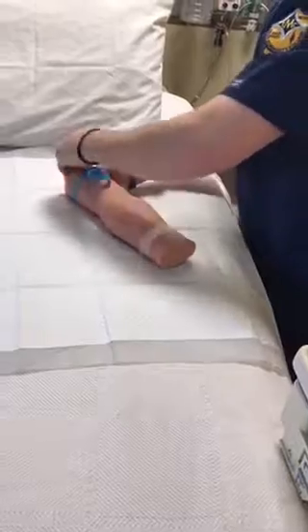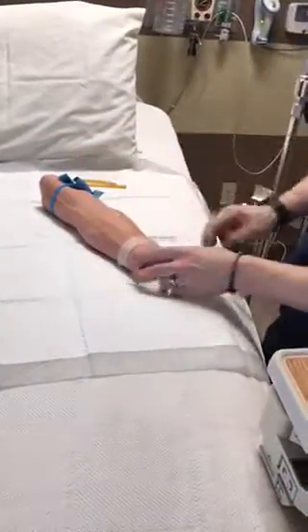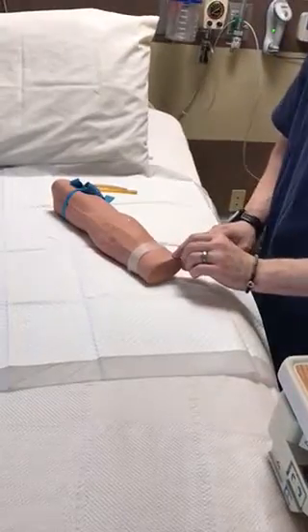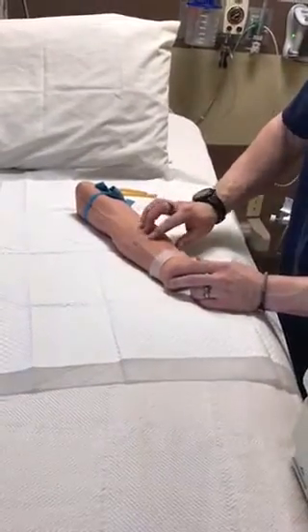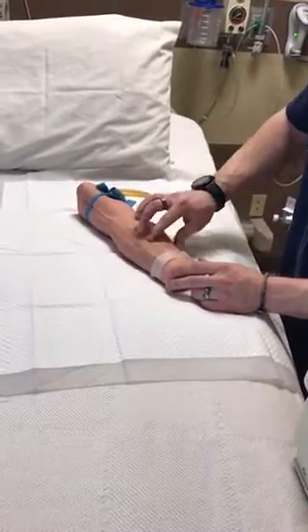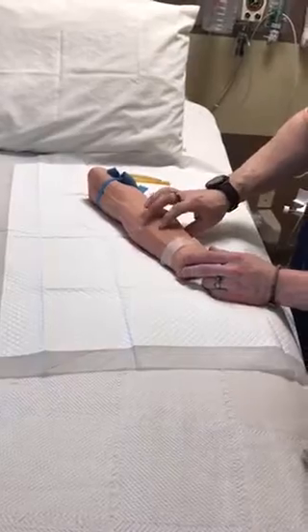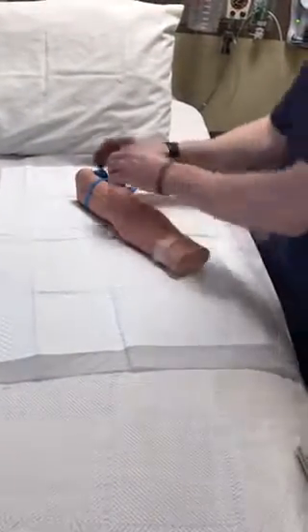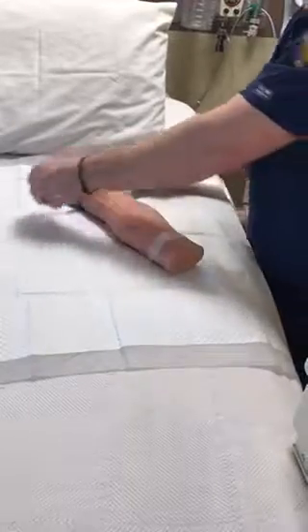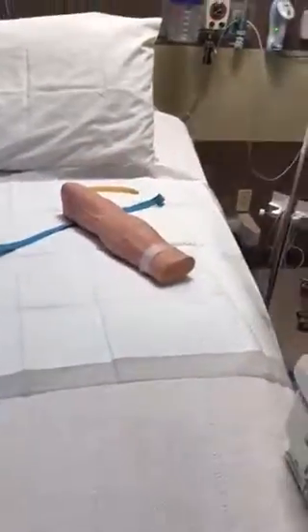tourniquet like that, and I'm going to go ahead and feel for a radial pulse, which you totally have. Going to select an IV site that has no hair, that way I don't have to cut it with scissors. That's a nice vein, it bounces back nice. Alright, and that's going to be the site we're going to select. So I'm going to go ahead and loosen that and leave it in place. You go ahead and leave your arm down like that for me for a second here, Bob.